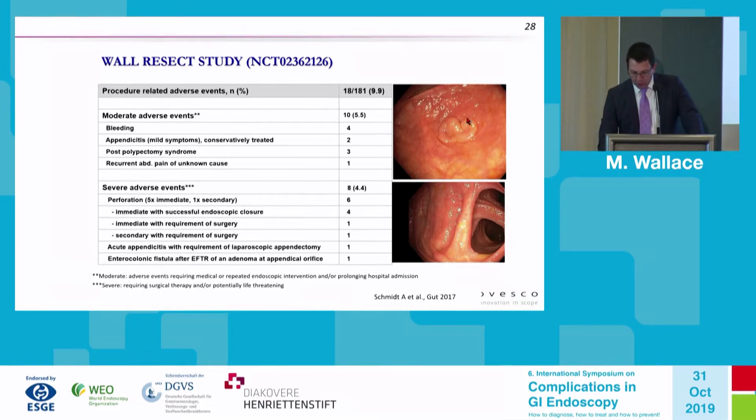The appendiceal lesion was completely removed, but the patient then developed diarrhea. At later inspection, a direct fistula was seen between the cecum and the adjacent small bowel — the small bowel had been pulled into the clip, the clip was closed, and over time it necrosed and created an enteric colonic anastomosis that would likely require surgical revision.